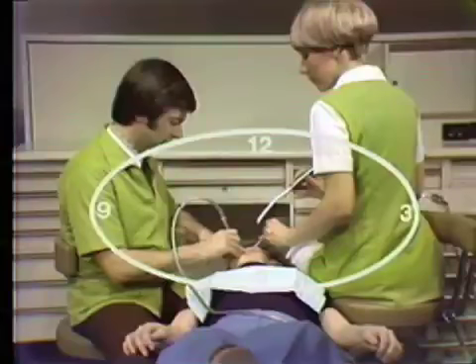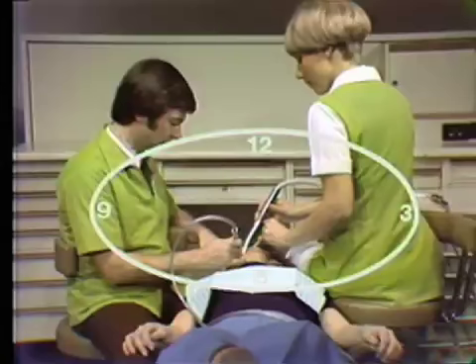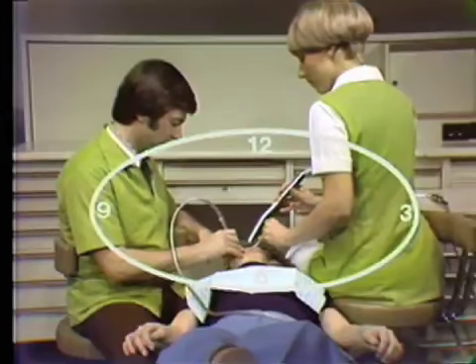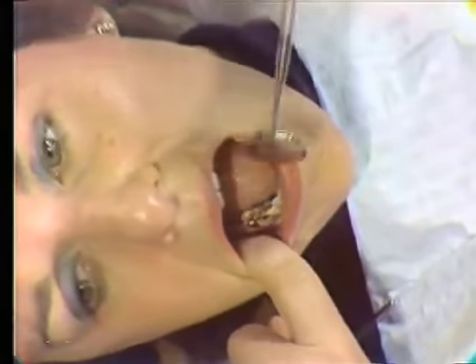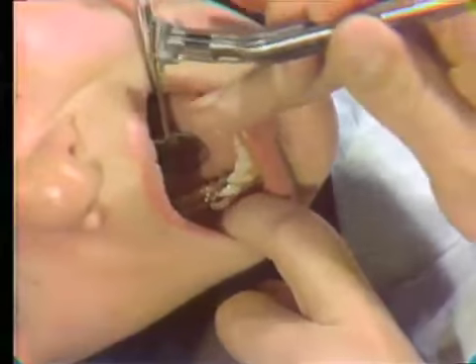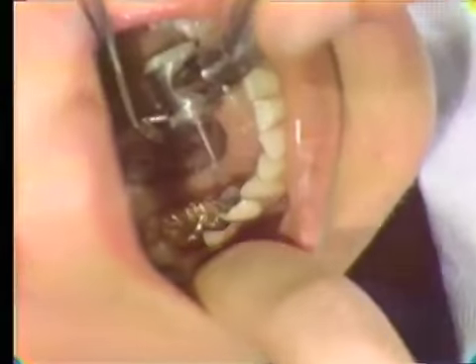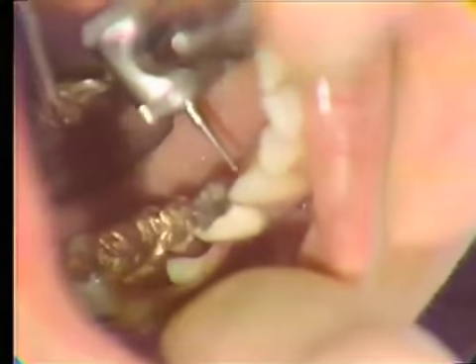The operator works from the 9 o'clock position. The dental chair is lowered to the maximum, and the chair back is raised until the patient's oral cavity is located at the elbow height of the operator. The patient's head is turned considerably toward the operator to gain as much direct vision and access as possible. The cheek is retracted with the operator's left index finger, and the tongue can be retracted with a mouth mirror by the chairside assistant. A finger rest can be established on the labial surfaces of the mandibular anterior teeth or on the buccal surfaces of the mandibular left premolar teeth.